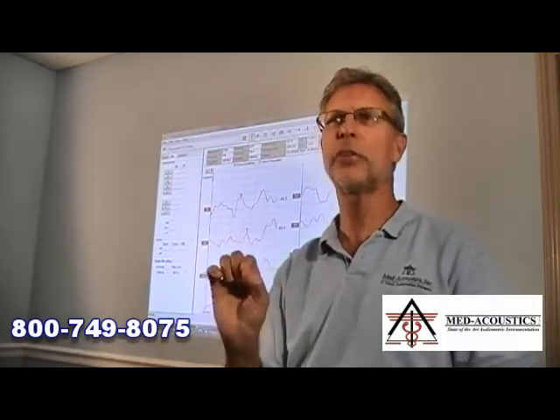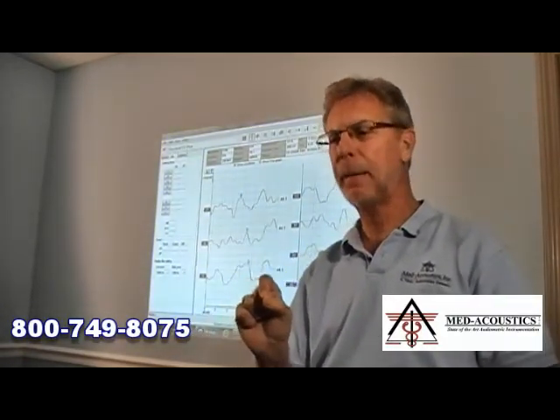On a conventional system, these responses with the patient up and active, or slightly active, would all be rejected, because all you can do is set a rejection level. So any myogenic artifacts would be rejected. So Bayesian weighting, right? That's a feature. And then there are others.